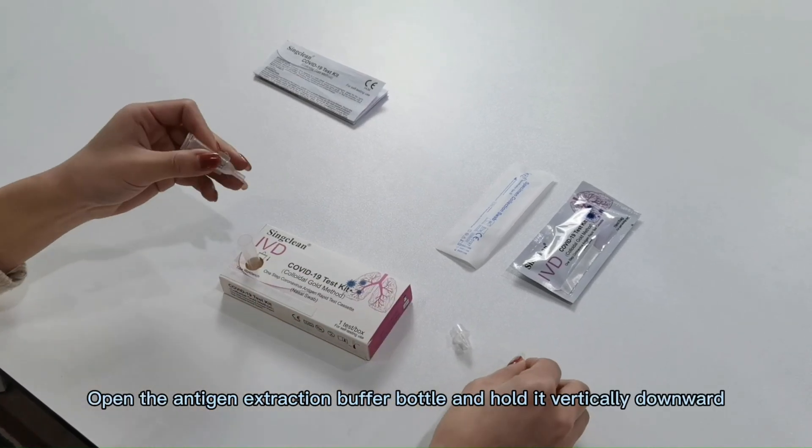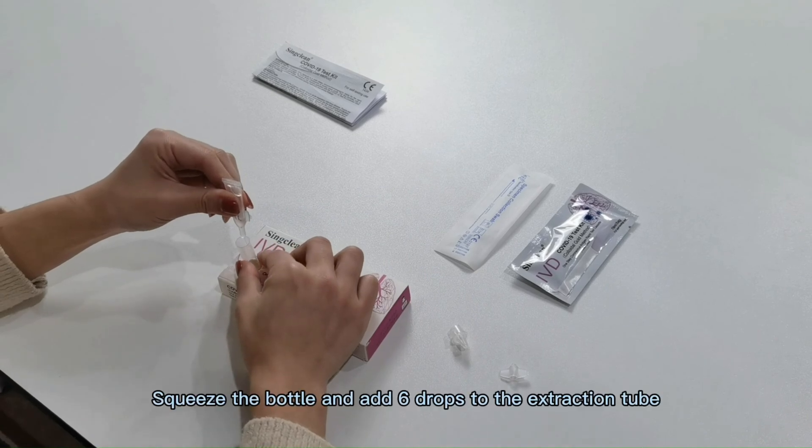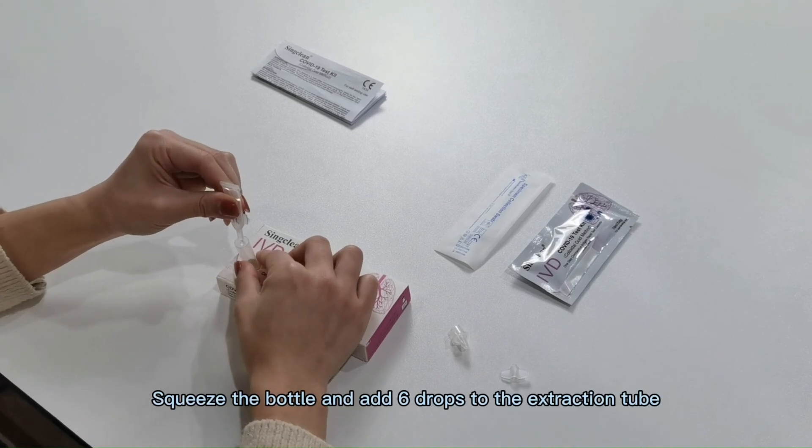Open the antigen extraction buffer. Squeeze the bottle and add 6 drops.